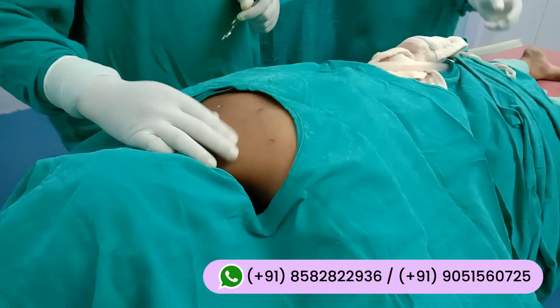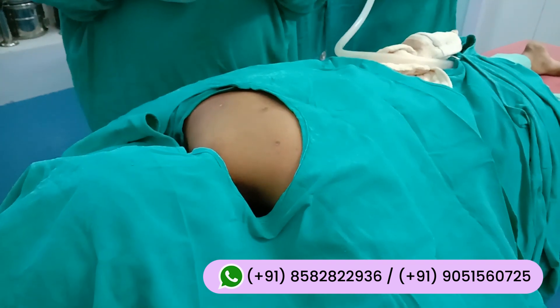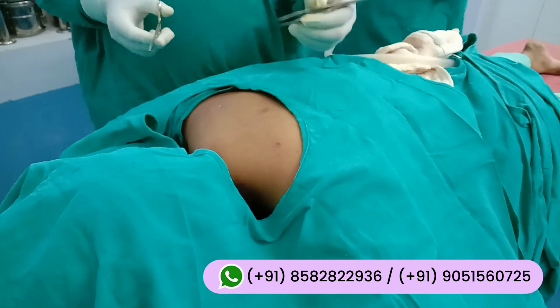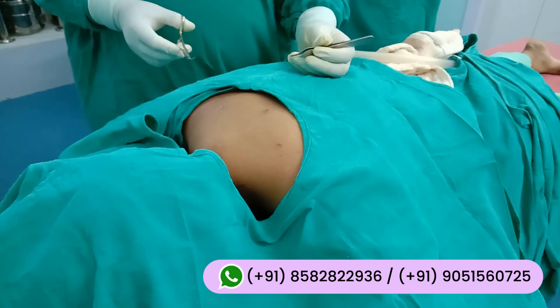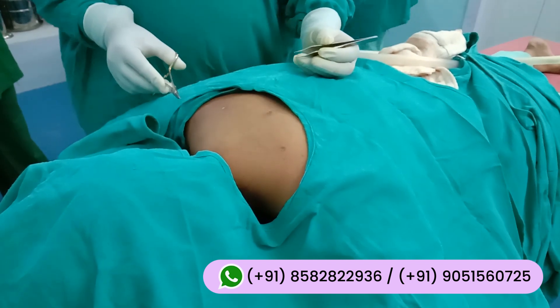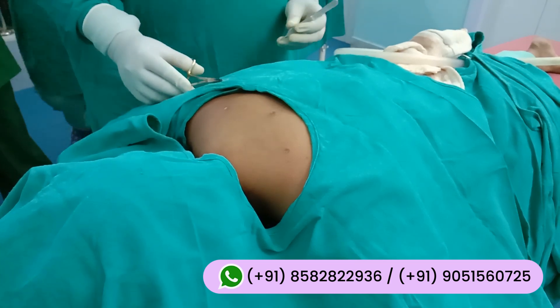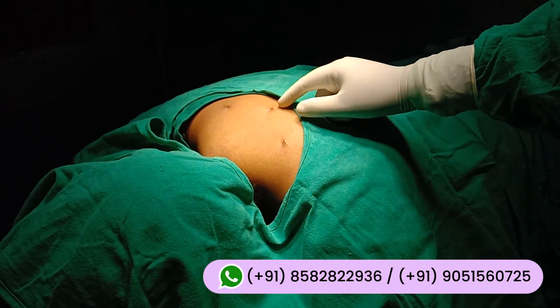The operation is complete. Friends, we have completed our surgery. Now we will be given small three stitches here only, and these stitches will be removed after 10 days. This is the end result — three small stitches.